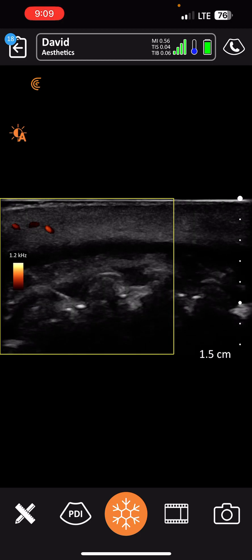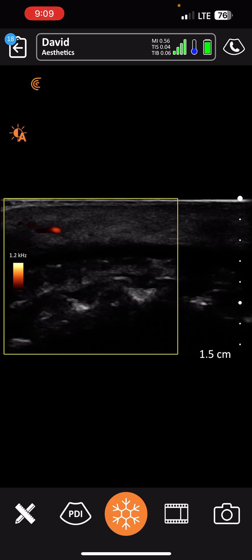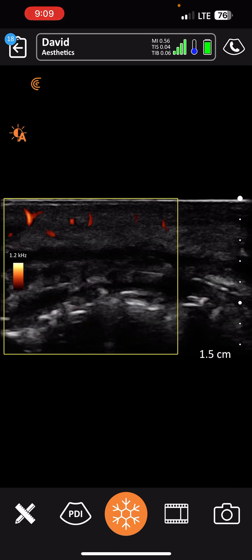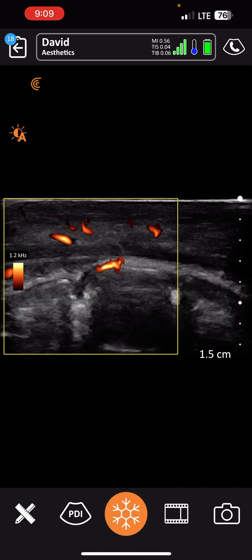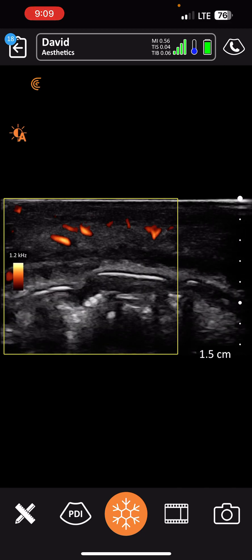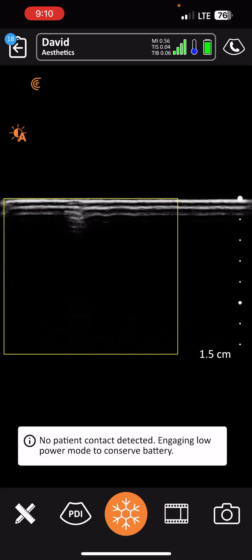You can see pulsating throughout right there. She has good blood flow throughout the entire inferior labial artery, which is excellent. She still doesn't have any pain and she's not having any skin breakdown on the outside or the inside. This really does look like a dependent bruise.